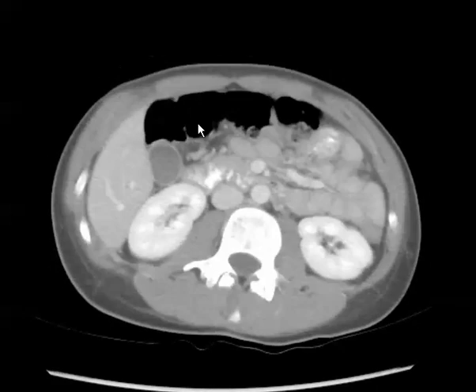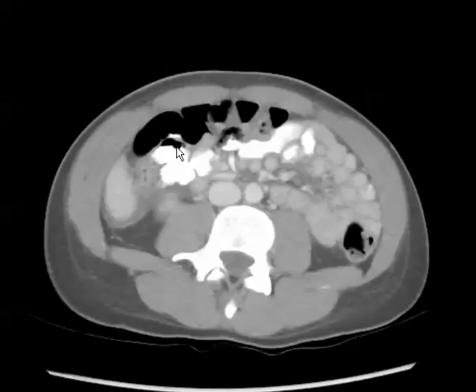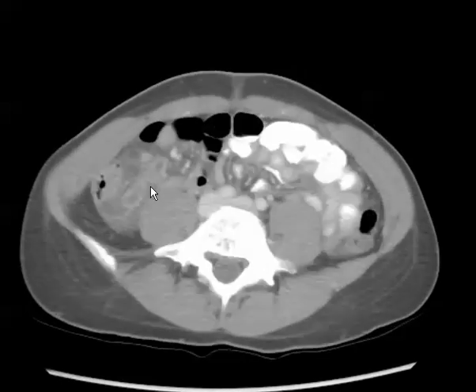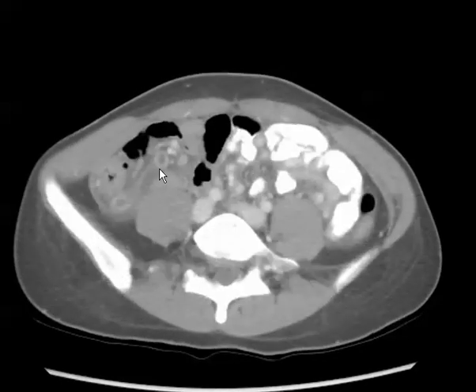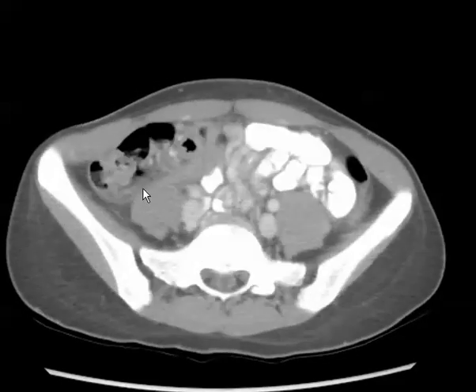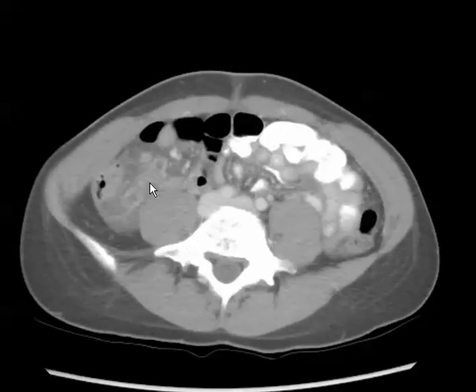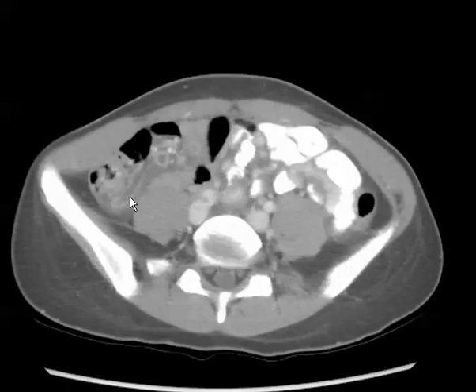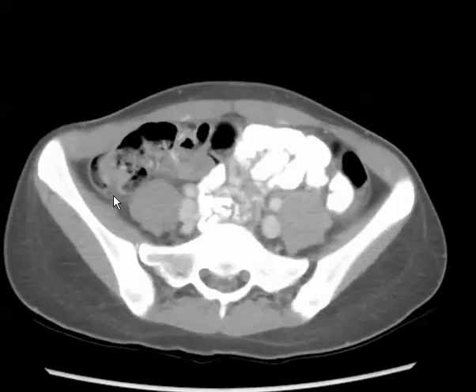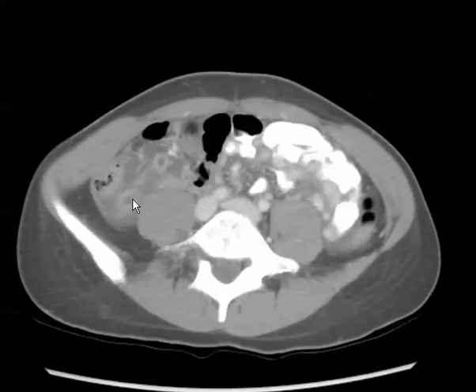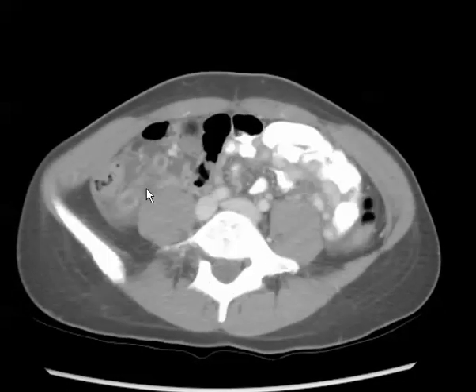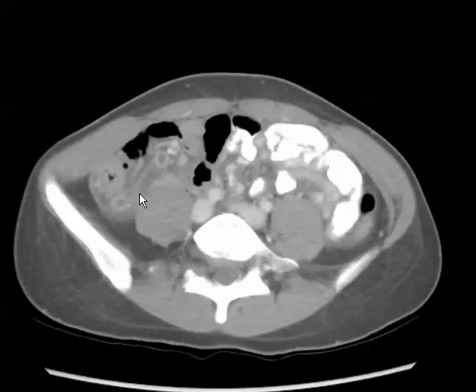As we scroll through the images here, within the right lower quadrant, we already see a dilated tubular fluid-filled structure, which is the appendix. It is coming directly off of the cecum here. The appendix is dilated, measuring greater than 6 millimeters.